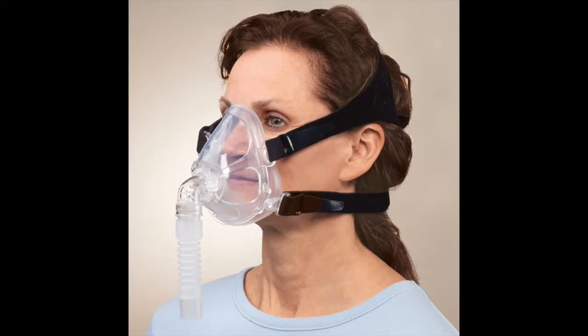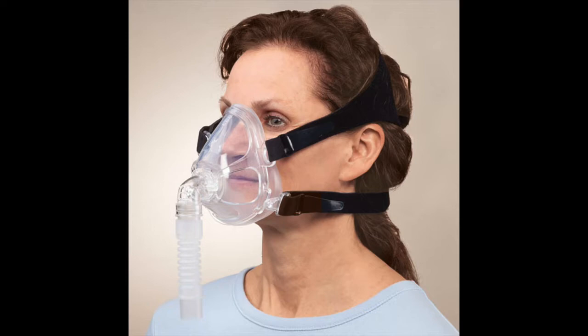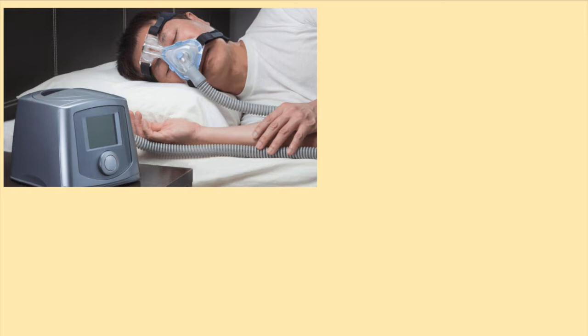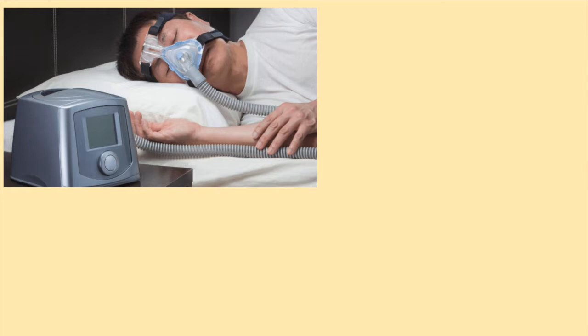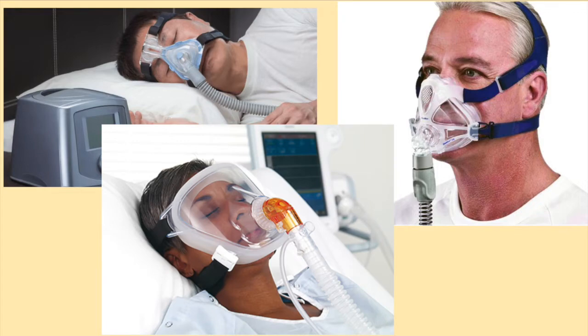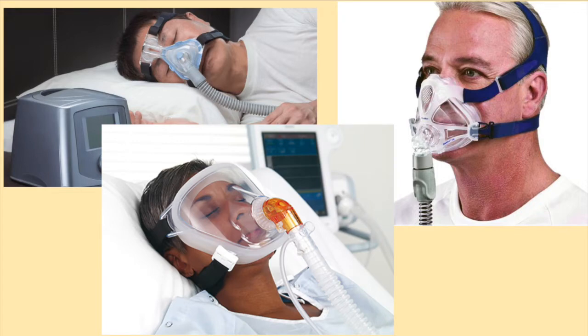Non-invasive ventilation replaces the breathing tube with a tight-fitting mask. Depending on the design of the mask, it may be placed over the patient's nose, the nose and mouth, or the entire face. With the ventilator turned on, positive airway pressure pushes air into the patient's lungs with each breath.